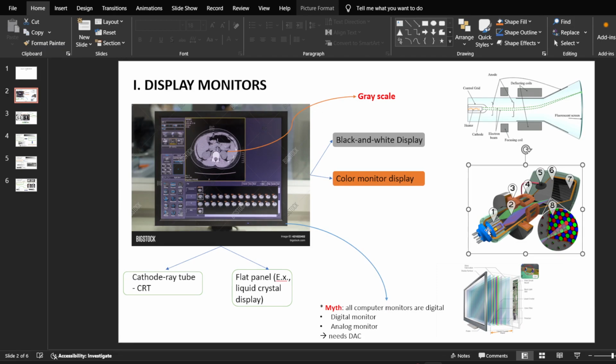That is a CRT type of television, right? Because you have an electron gun, and from this point you get an electron beam right here, and the beam will bombard the screen, and from the chemical reaction behind the screen you will get, my friend, the color.